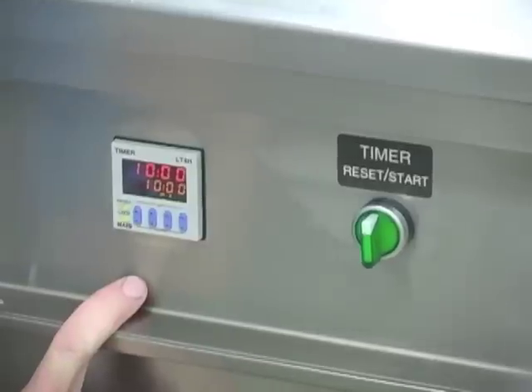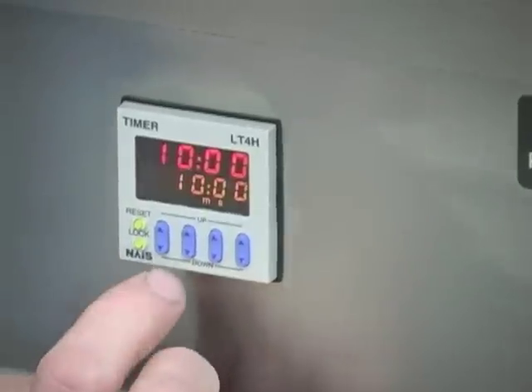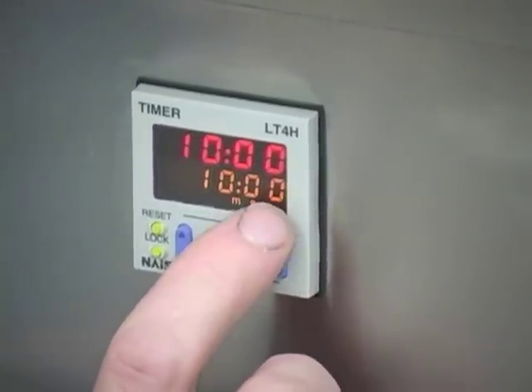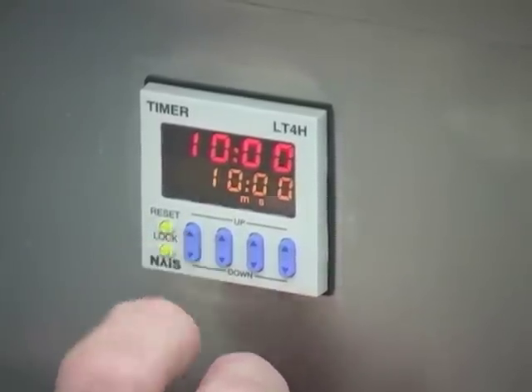Depending on the soil level of the tooling, you might need to go to 15 minutes. To adjust that, there are four buttons — up or down based on the digits: seconds, tens of seconds, minutes, and tens of minutes.